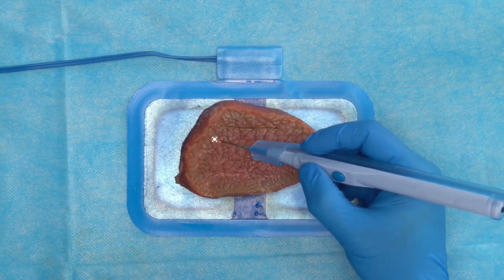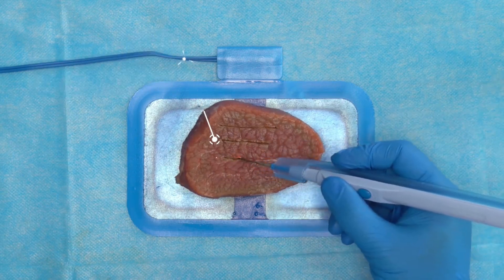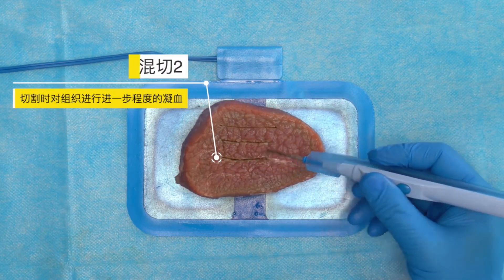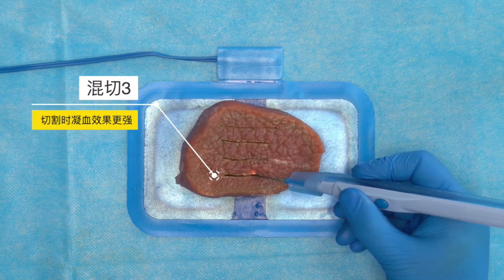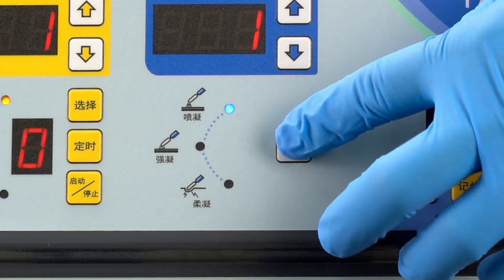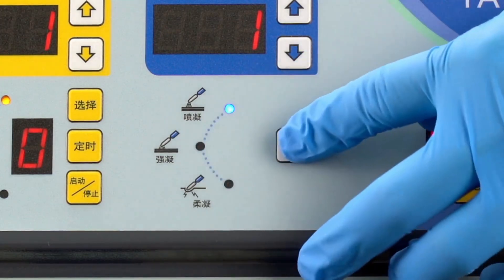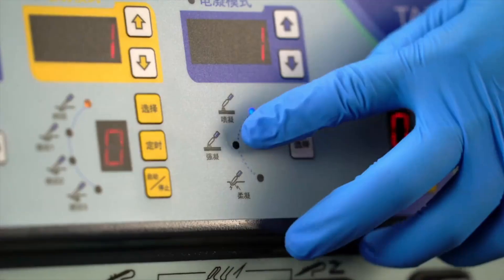Blend cutting one mode can coagulate the tissue to a slight degree while cutting accurately. Blend cutting two mode can perform a further degree of coagulation on the tissue during cutting. Blend cutting three mode has a stronger coagulation effect when cutting.